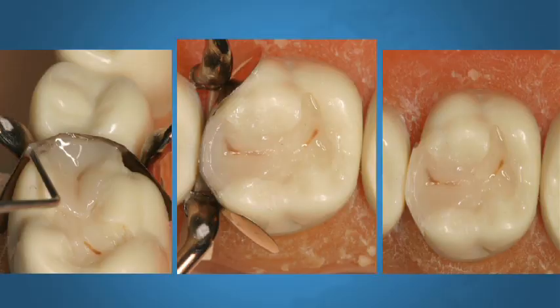The next step will be, on the marginal ridges, I'd like to use an explorer to remove the flash, to remove the excess, so we have the least amount of flash as possible. After curing, and after removing the matrix band, you can see that our restoration is almost finished.